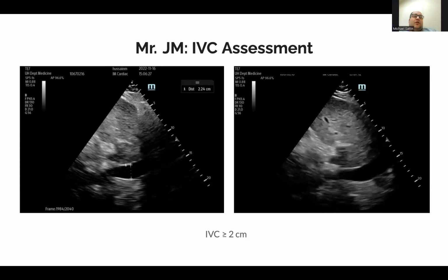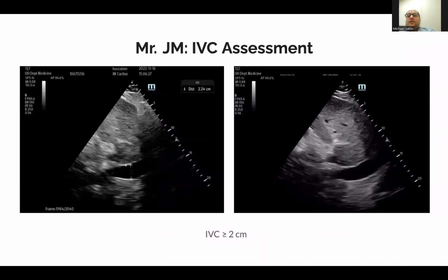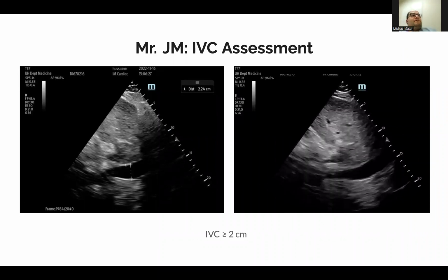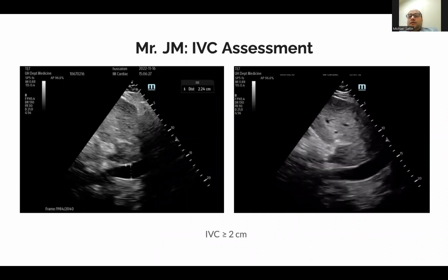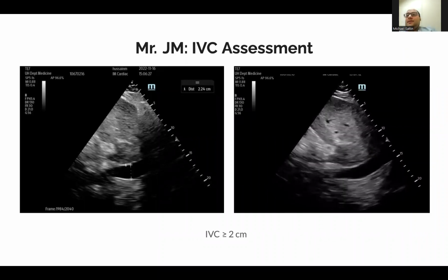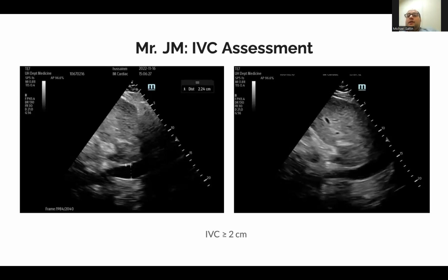Perfect. Yeah. So I mean, it's a great case. I think you've already talked about the caveats with the AFib, difficulty interpreting some of the waveforms. And I think the other thing that's always important is just not getting tunnel visioned when we're doing these assessments, and making sure that someone comes in with elevated RVSP but a dysfunctional right ventricle, thinking about the common things being common, and ruling things like PE out before we jump into just diuresis and call this new pulmonary hypertension and right heart failure.